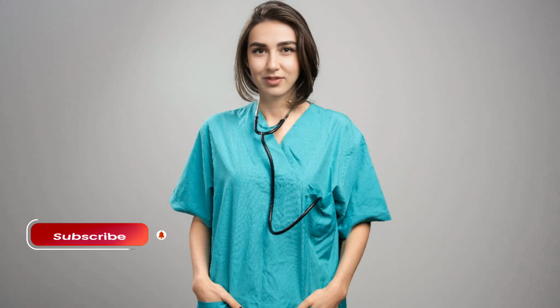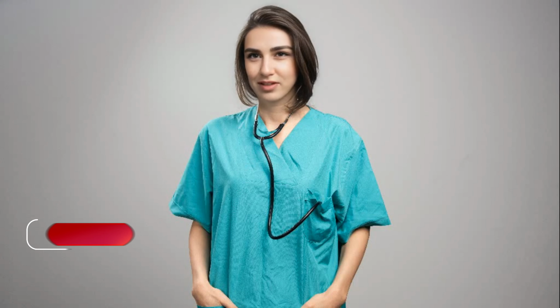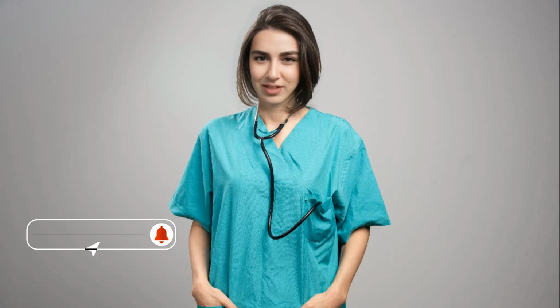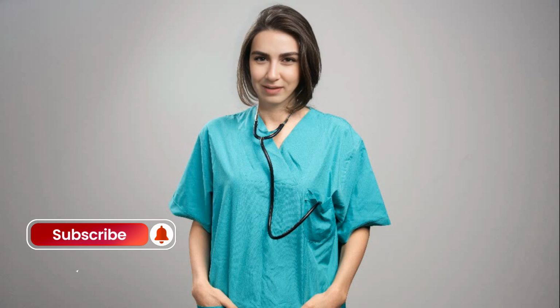3. Injecting contrast dye. Once the catheter reaches the targeted artery, a special contrast dye is injected. This dye makes the blood vessels visible on X-ray images. The patient may feel a warm sensation as the dye is injected, which is normal and temporary.